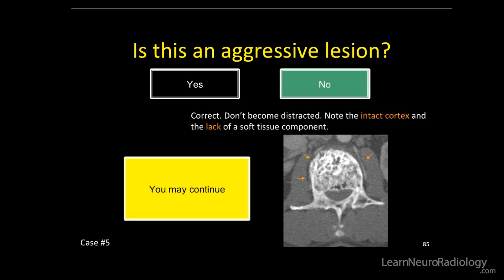No, correct. Don't be distracted from the large adrenal tumor. There's an intact cortex and a lack of soft tissue component. Don't jump to just say this is a metastasis — it's not. You can see a very nice paraspinal fat plane around the cortex of the vertebral body.